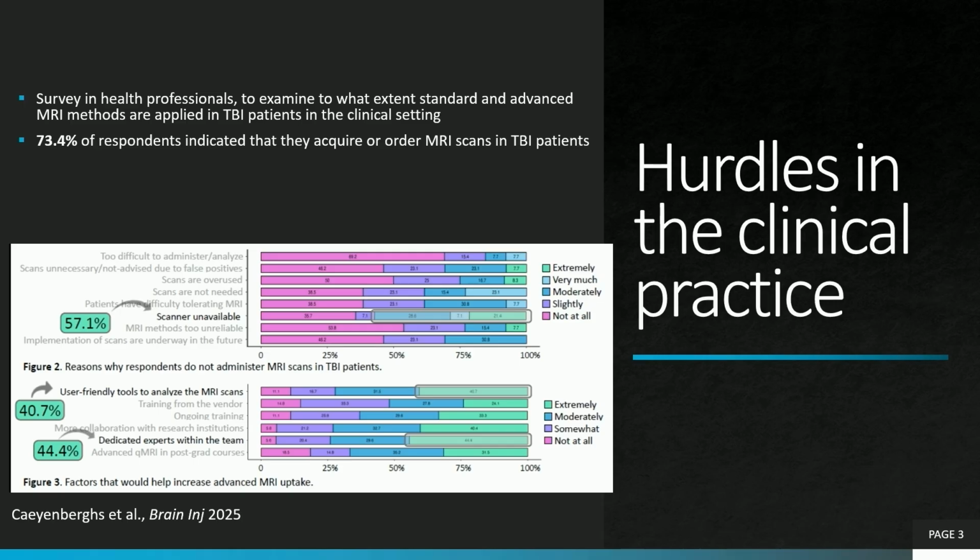We were really interested to see the reasons for not administering MRI scans. One of the main reasons was the availability of the high field MRI scanner, and by high field I mean 1.5 Tesla or 3 Tesla, which was not available for these TBI patients.